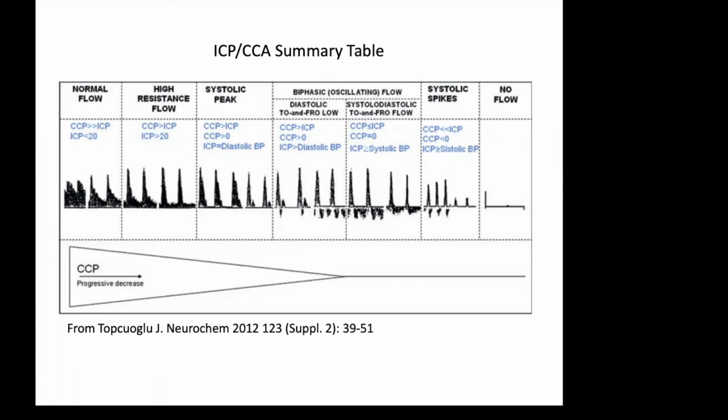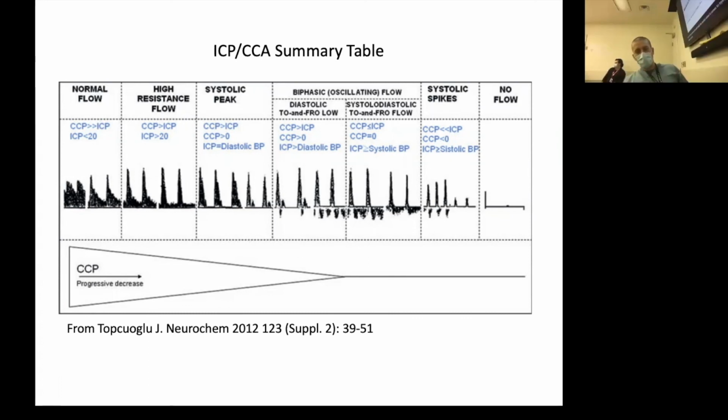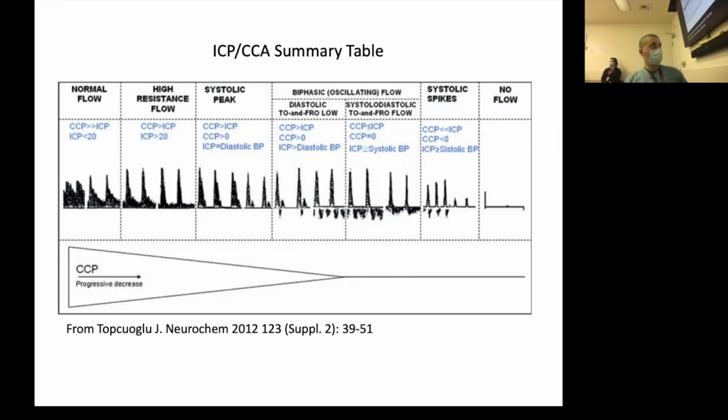Yeah, it does. So it's one of those applications for point of care that we should be careful of when trying to make a call on vasospasm. Yeah, I think with point of care ultrasound, you should be able to detect vasospasm in MCA territories and reliably say that is vasospasm based on a high mean flow velocity or high peak systolic velocity and a normal extracranial ICA velocity. But I would be more cautious with the other intracranial vessels based on the paucity of literature on them.